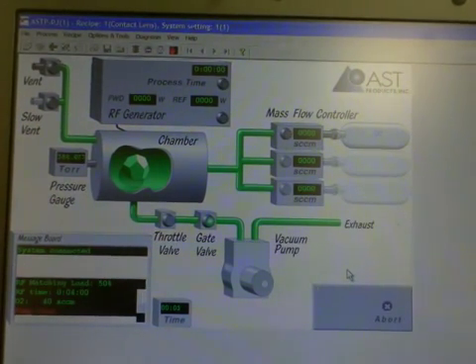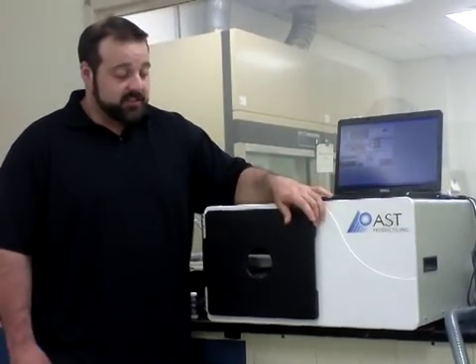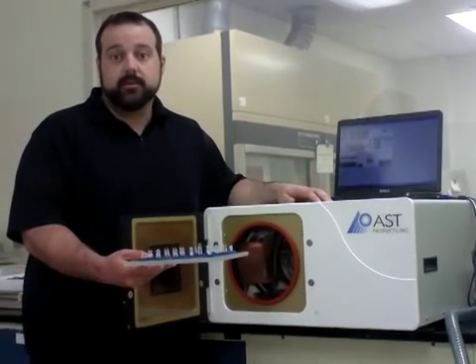The software will begin and the run will start. Once the cycle is completed, you'll hear a beep from the PJ system letting you know it is finished and ready to be unloaded. Simply take the tray out and your contact lenses are all treated. That concludes our video. If you have any questions, please email us at inquiry2012@astp.com.